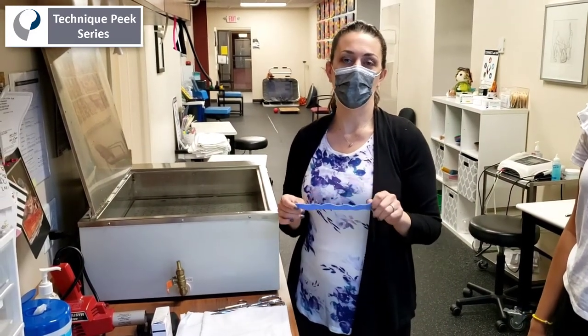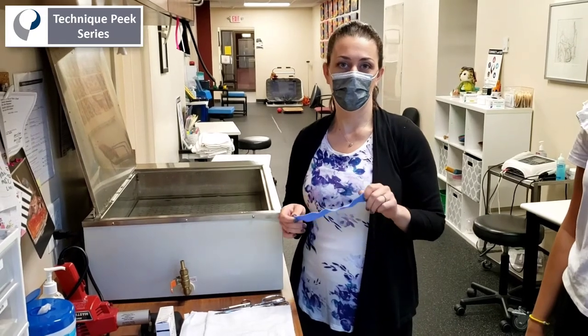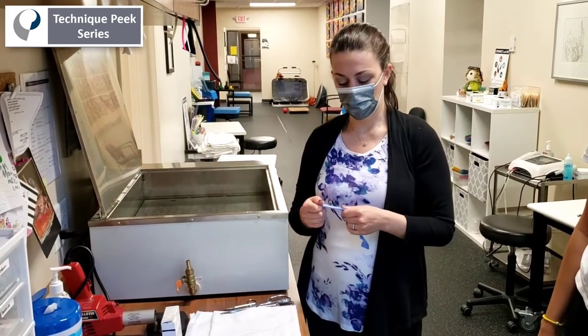The difference here is that this stays on full-time in between sessions, and we usually change the cast bi-weekly to keep up with the progression of PIP joint extension.